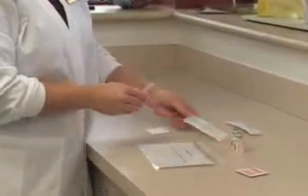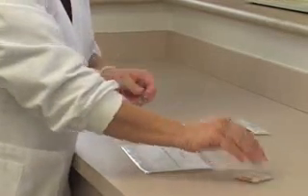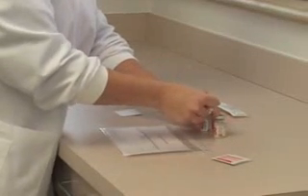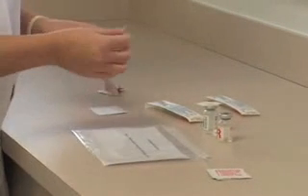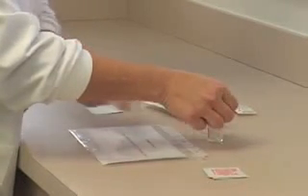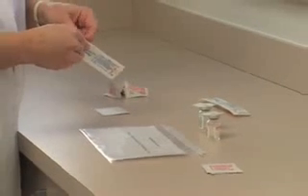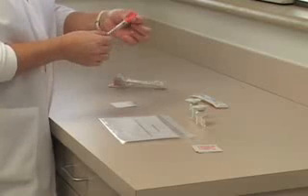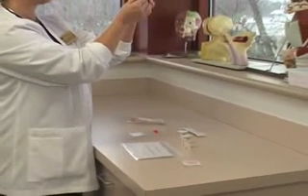Wash your hands. Clean rubber tops of both vials with alcohol wipes. Remove cap from needle. Draw up air equivalent to the total amount of insulins to be given.